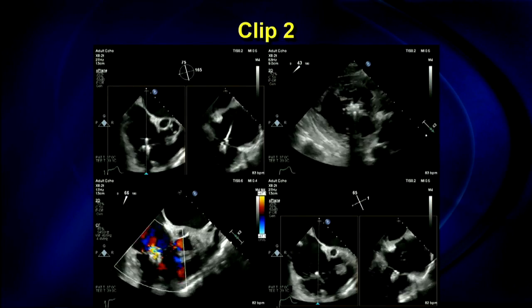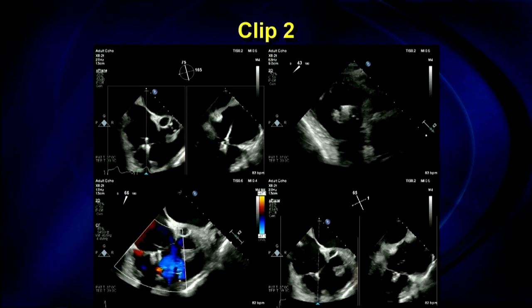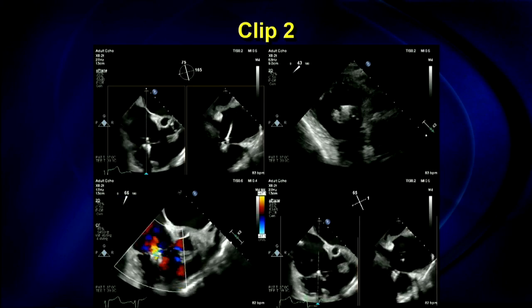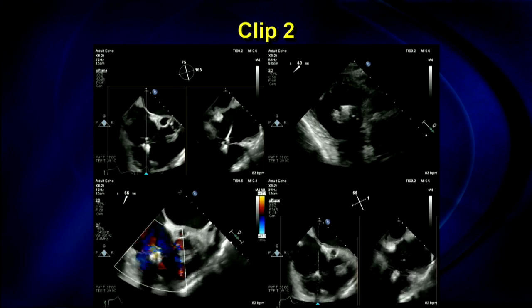So based on that, we put another clip in, just anterior to the first clip. One problem with this view is if you put another clip anterior to the first clip, you'll get some acoustic shadowing from the first clip. But here we have a nice result.